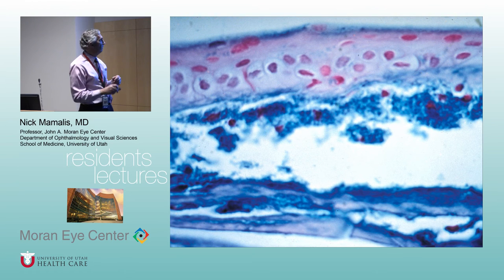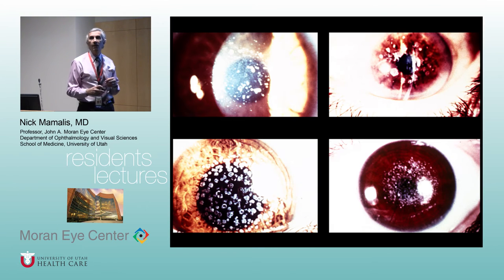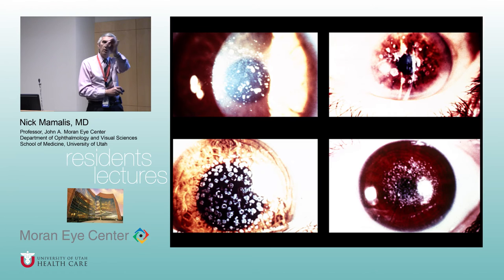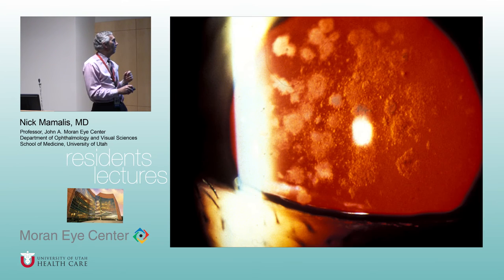Granular. And the difference between granular and macular is if you look, you see these individual granules. It's well named. Now here's macular up here. Here's granular down here. Look, it's like cookie crumbs, but notice the clear spaces in between. So it's like there's little breadcrumbs in there, but there are clear spaces in between.